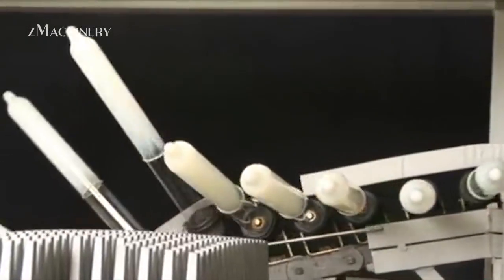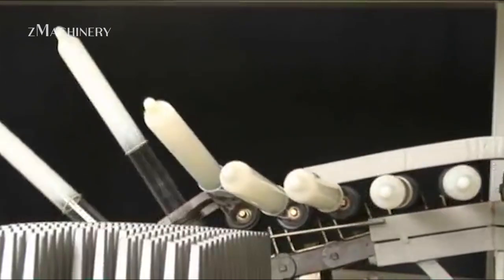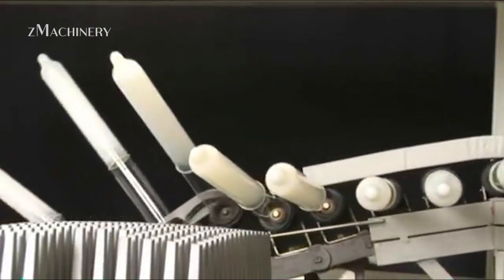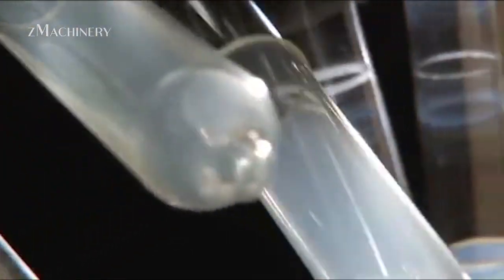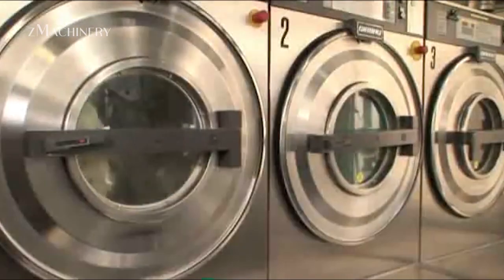After curing, the now-solid condoms are carefully stripped from the molds using automated machines or compressed air. But before they can be packaged, each condom undergoes rigorous quality control. Quality testing is one of the most critical steps in the entire process.